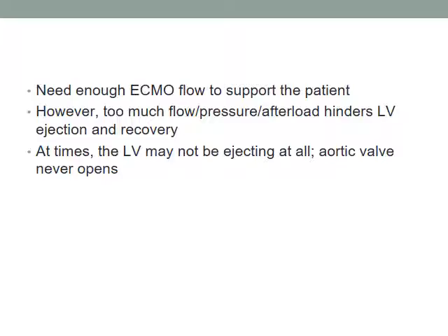Yes. So the pulse ox, I know you said that you wanted to get ABGs off the right radial. Would you want the pulse ox on the right side? Right and left. I'd like to have two pulse oximeters, right and left. And I've had patients where the right side is 72 and the left hand is 98. And it's not wrong.